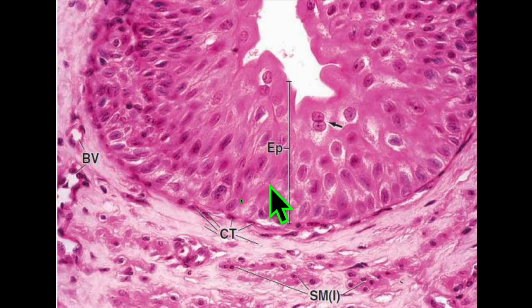The basal cells are the smallest, and typically the nuclei appear crowded because of the minimal cytoplasm of each cell. And the intermediate cells appear to consist of several layers and are composed of cells larger in size than the basal cells but smaller than the surface cells. So that was in general about the histology of the ureter.